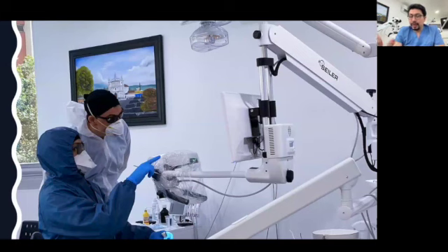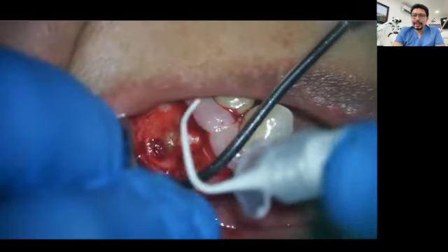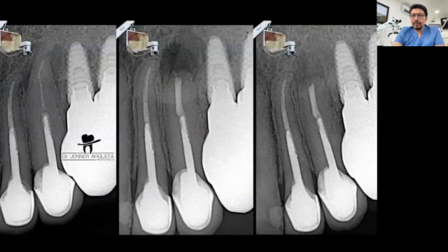And when you work, I do my periapical surgeries working with my wife. You have your colleague just beside you seeing what you are doing. And you can have an exchange of ideas in real time and analyze what you think. Maybe it's better to go in this way, it's better to go in the other way. Two heads always will think better than one, and you can have that communication at the same time. What we look for is to have healing in the area.